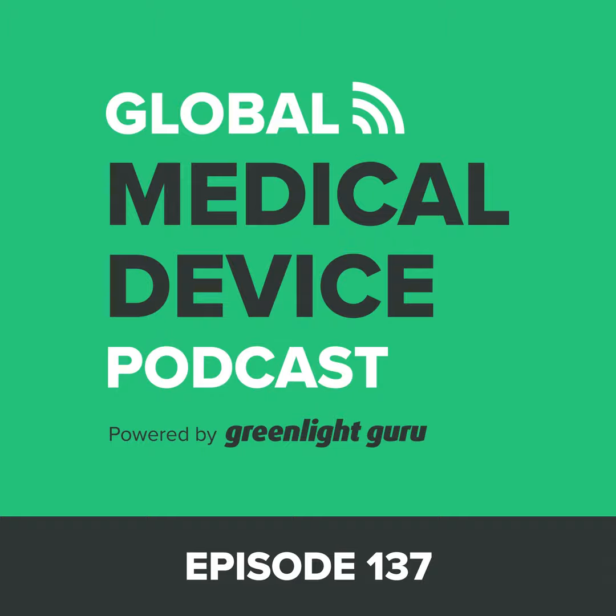And you could have different software items. That's the term they use. I think most often in software we think of software components or software modules, but the term used in 62304 is software items. And once you have your software hazard analysis done or started, then you can define different software safety classes for those individual items. And then that will give you different processes that you need to follow for those higher risk items.